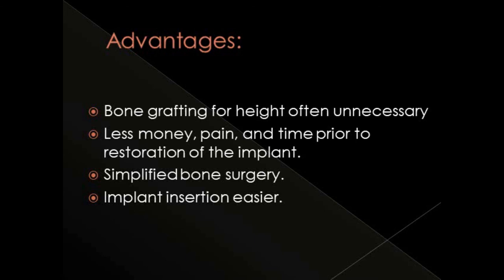But the long-term success of short dental implant is conflicting. Some studies say that the failure rate of short implants are high when compared to that of the traditional implant, whereas some recent studies say that the success rate of a 5 millimeter dental implant was about 80 to 100% for over a 1 to 8 year of evaluation. So the long-term success is just conflicting.